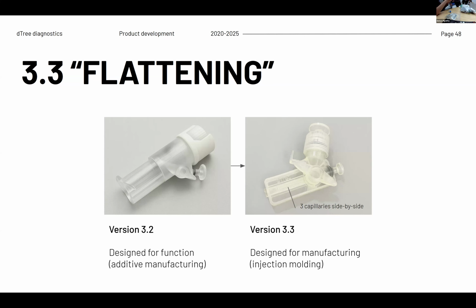Or what we're doing is literally just tap it. Works really well. So like 30 seconds, I can tap it and it will just transfer the liquid really well. So all this pink side here, don't worry about the color. I'm just referencing the chamber. Basically, you can see that now everything is aligned essentially, right, from top to bottom. So if I tap that liquid there, it will go past.